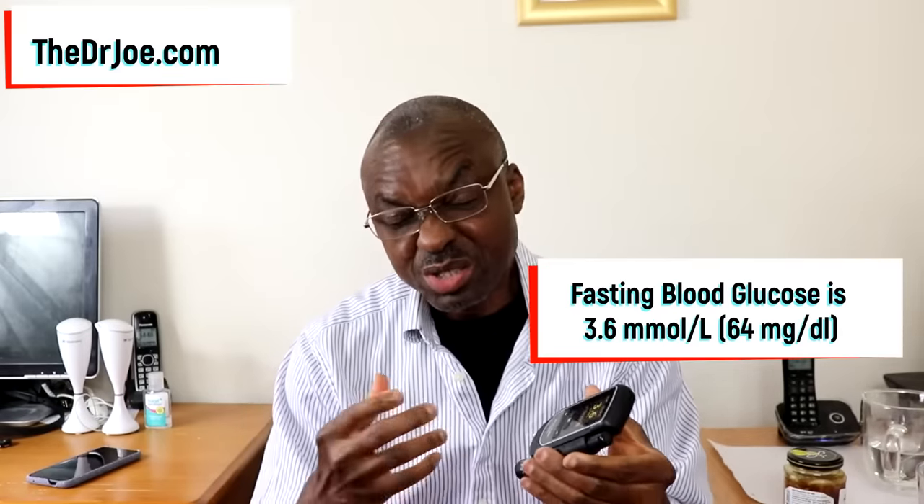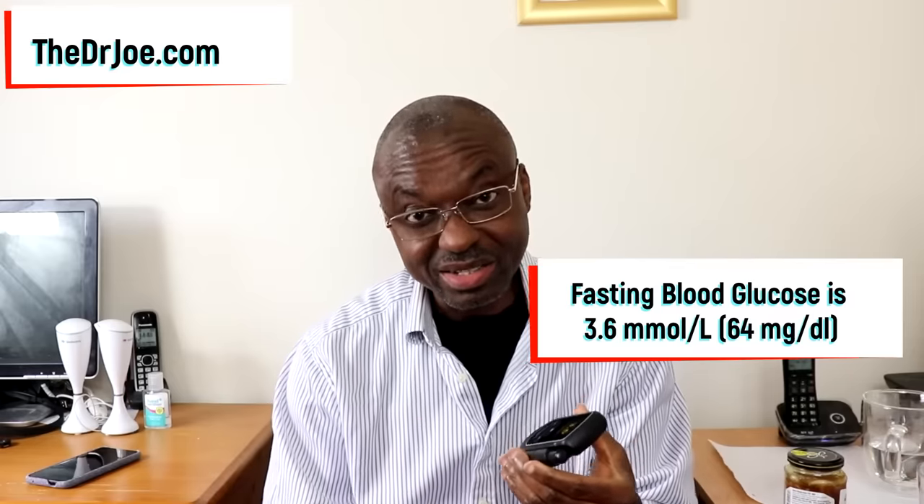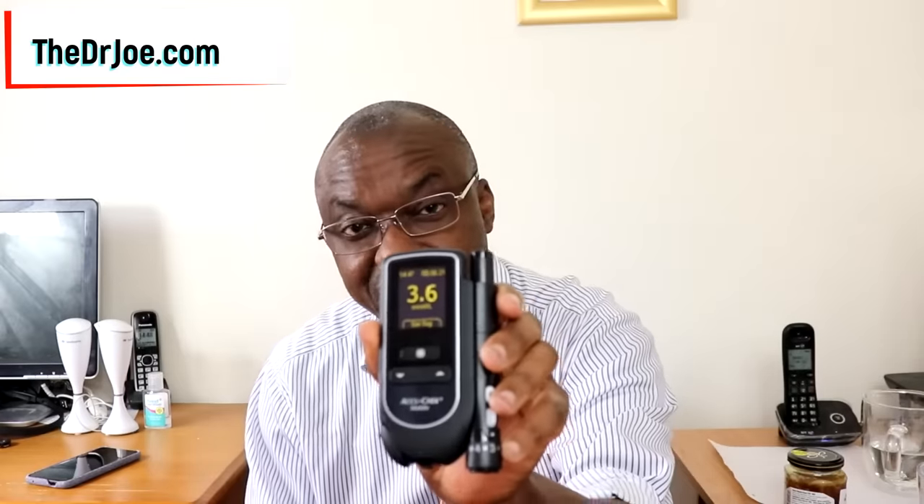So let's do the before test. I'm just going to turn on the blood sugar monitor. It's ready, so I'm just going to prick myself and then squeeze out some blood. Apply it to the monitor. This is my blood sugar reading now — it's 3.6 millimole per litre. If you multiply that by 18, it gives you the milligram per deciliter reading. This is fasting, by the way — I haven't had anything to eat or drink today.